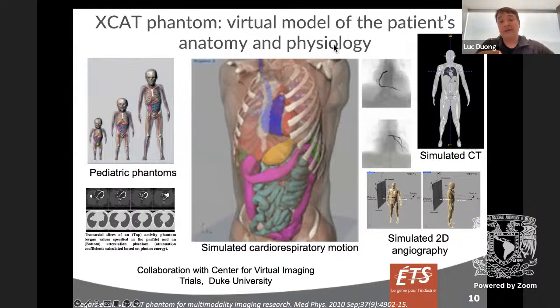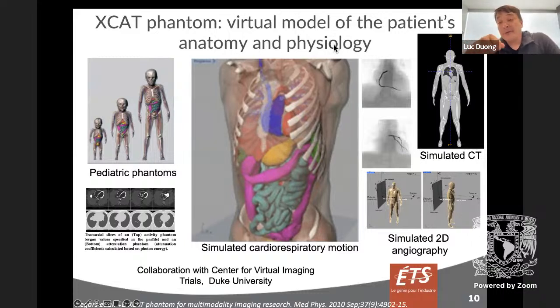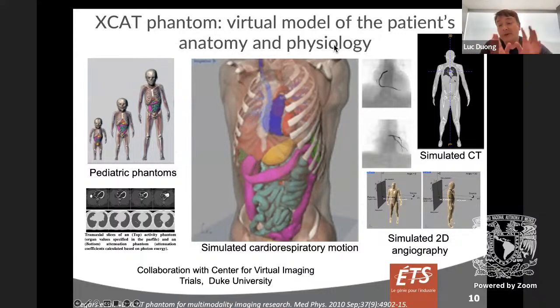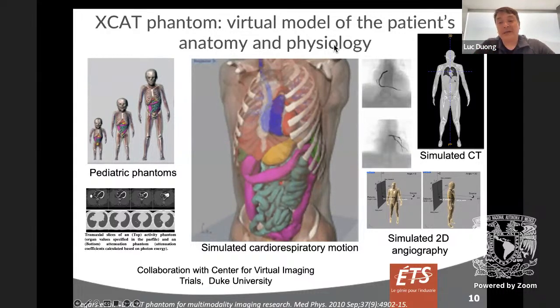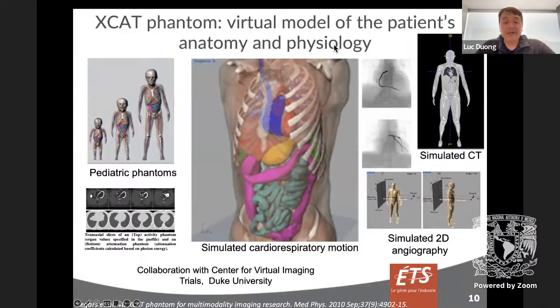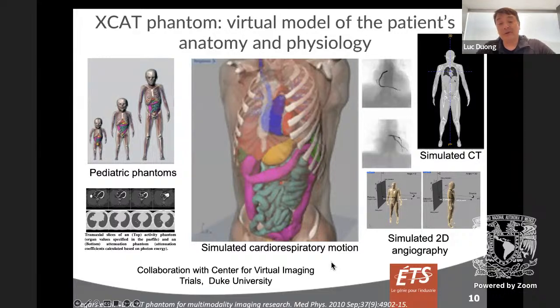We have the ground truth 3D reconstruction of the coronary artery, or any artery that we want to reconstruct. We have the ground truth, and then we can compare it with the one that we are reconstructing, and we can see exactly what the errors are that we are committing in the perfect world, where there's no calibration issue, where everything is already controlled, but the only difficulty is the reconstruction of the anatomical structure, for instance. And it was really helpful for us to use that kind of phantom, because that allows us to validate our work and to see how far we were from the truth, I would say.